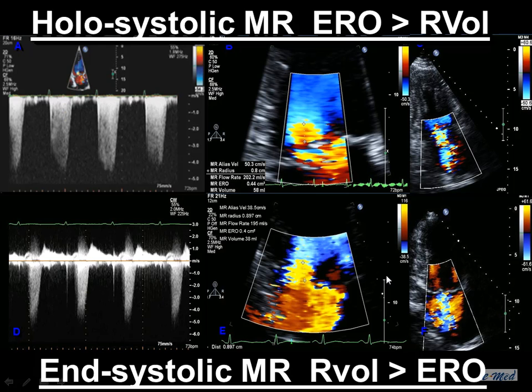The regurgitant orifice is the same. The flow convergence is the same. Pay attention to that.